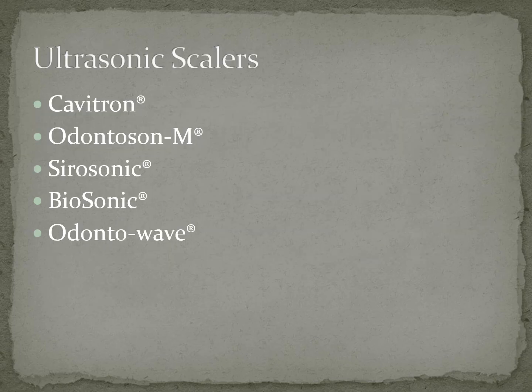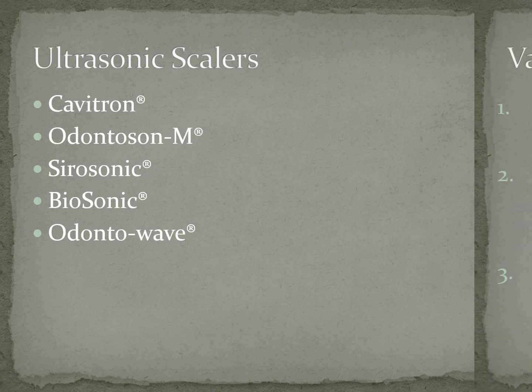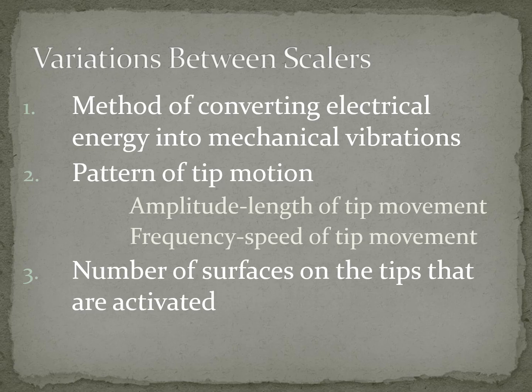Okay, so as far as ultrasonic scalers, there's different brands. Now in the clinic, we have Cavitrons. So we have little Cavitrons in every unit, but that is not the only company that makes them. So there's just a list of different ultrasonic scalers that are available. Now the variation between these, they work by different methods of how they convert that electrical energy into mechanical vibrations.